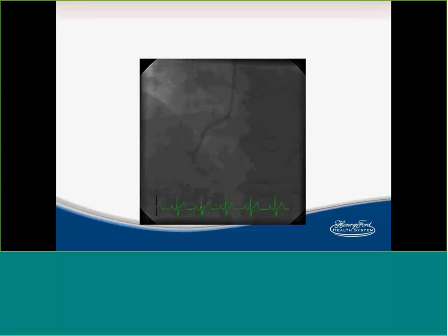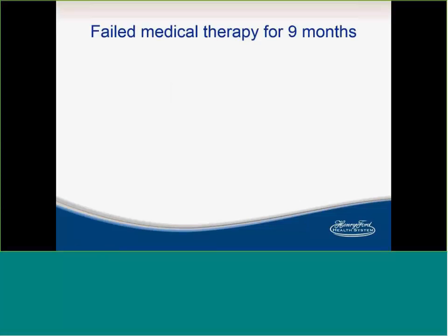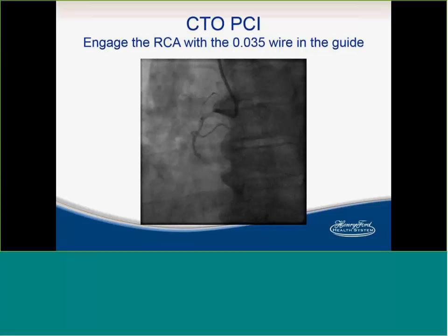I think you could count it that way, but at the end we had to treat it as a CTO. Sure. There is a distal occlusion in the RCA. You can tell there is kind of reconstitution here, and I think there was a stent in there. It was really difficult to tell. The patient was morbidly obese, so our angiography was also limited. The patient in November 2014 came to his doctor with this, and they did the angiogram and advanced medical therapy, and 9 months later he came to me. So it's a CTO now, exactly.